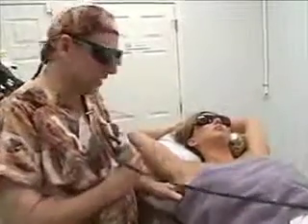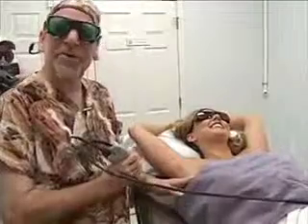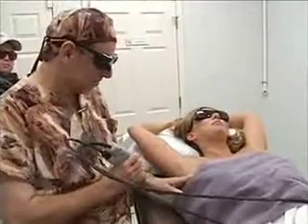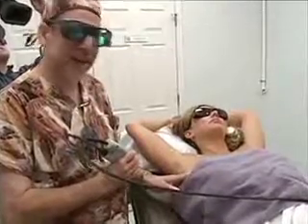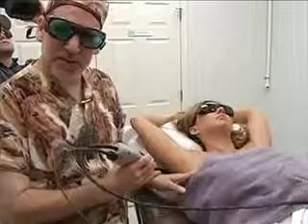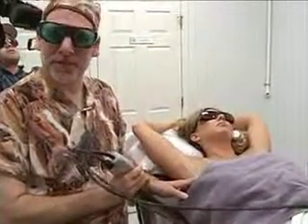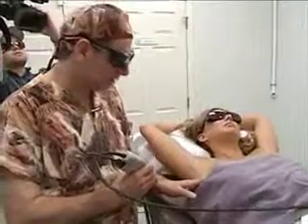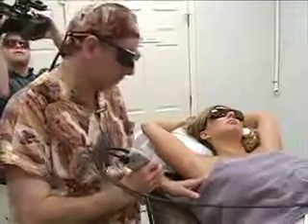My name is Kevin Vickner. This is Renee — she's one of our patients and we're going to laser her with a different laser. We lasered the last girl with the Indy Yag. This laser is an Alexandrite laser, and we can use it on skin types one, two, and three, sometimes four. But we can't use it on dark skin — it will burn them. So this is a special laser for lighter skin people.